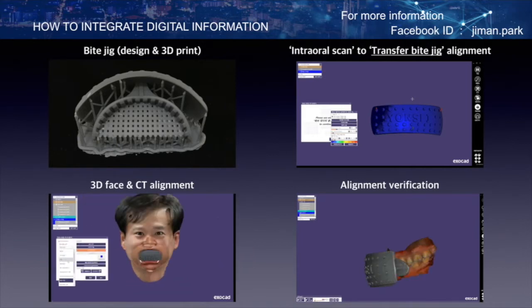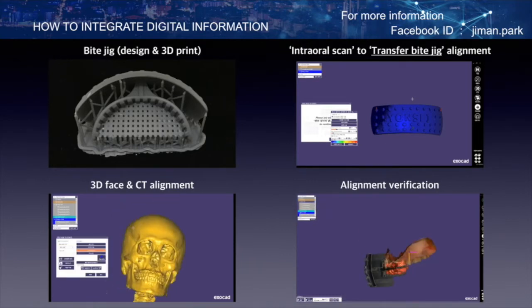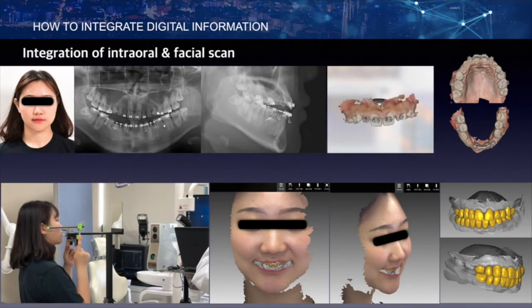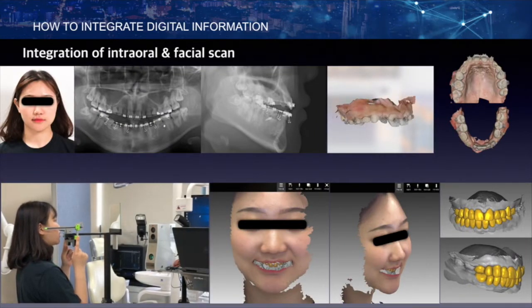So the final evaluation image is like this. This video clip shows you how accurate this alignment process is. With the integrated virtual patient, you can establish a treatment plan very easily because you can see the diagnostic teeth design and her face at the same time.